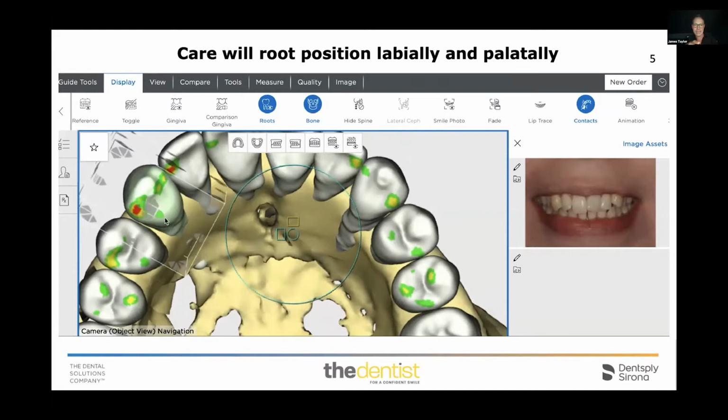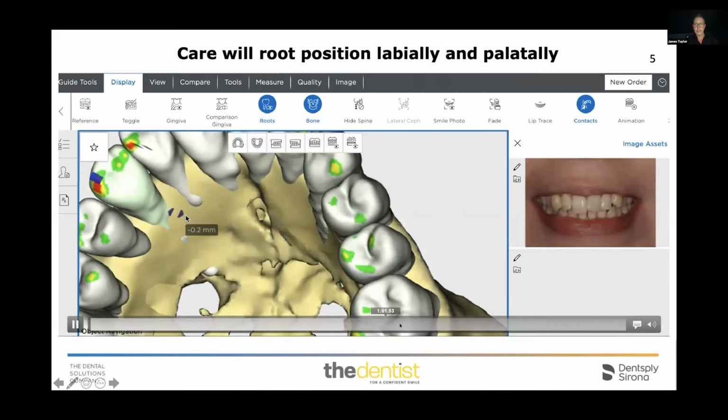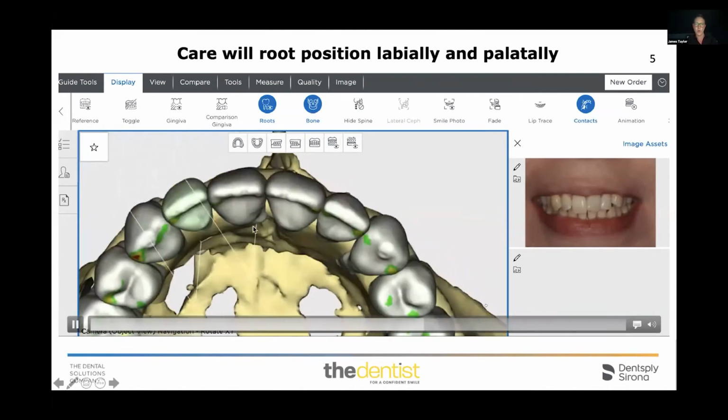And I often take the gum away and just work with the teeth and the bone, because then I'm really looking at the real detail of the teeth, the position. I can also take the bone away and I can look at the roots on their own and make sure there's no clashing or interaction of the roots with each other, which, you know, often, especially the lower anteriors, is very hard to tell from just the coronal aspect, where those roots are and what's coming into contact with what.